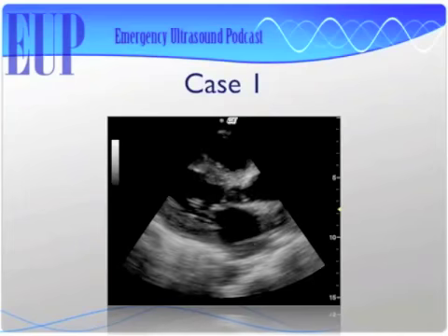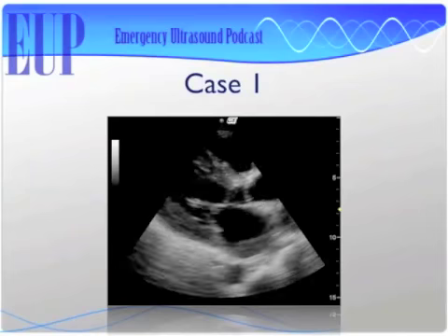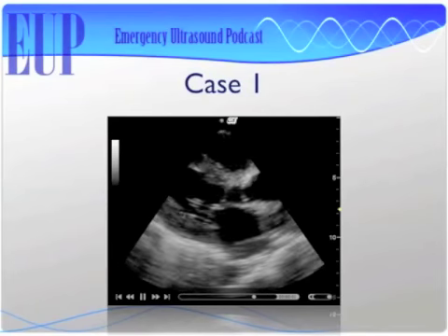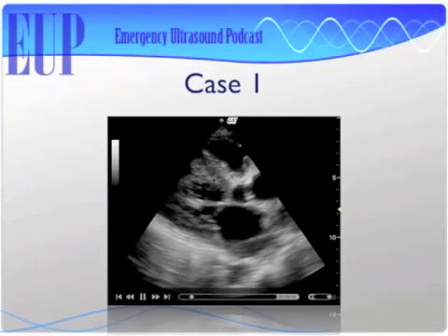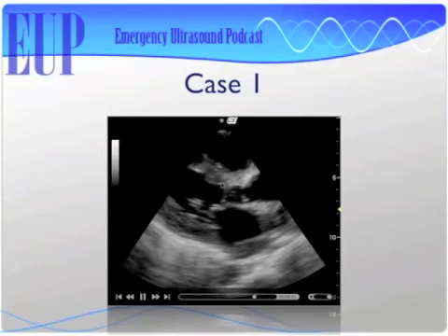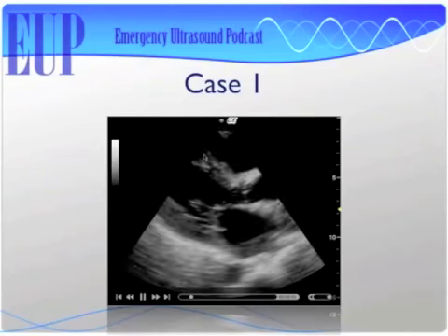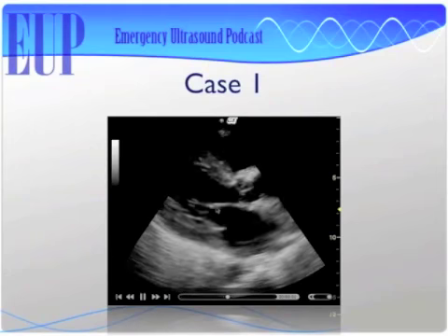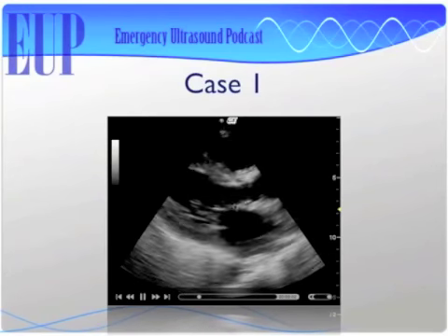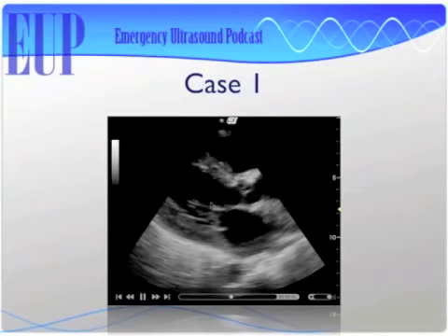I see right ventricle, then left ventricle. I see a left ventricle that is not squeezing all that well. So Matt's talking about this area right in here, and you're saying you don't feel like this left ventricle is squeezing very well. No, I see poor function. Why would you tell me that? I see an aortic and a mitral valve that are not opening appropriately. So here, like the anterior leaflet of the mitral valve, you're saying that's not coming up and touching the septum like you would want it to.